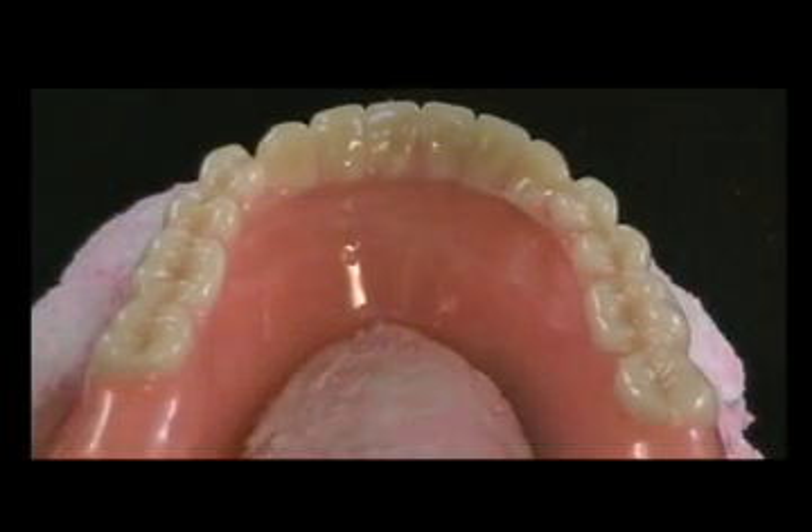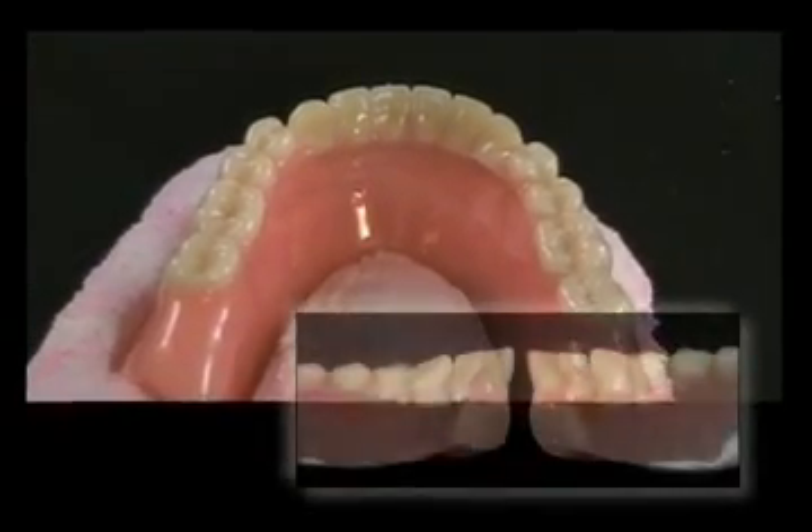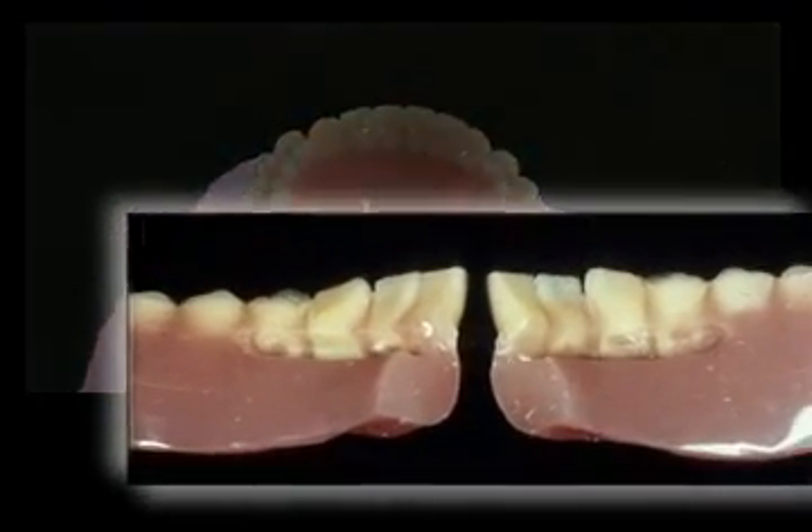The initial step is to correctly reassemble the fractured full denture and secure it with cyanoacrylate glue. Make a putty matrix to hold the assembled denture in its correct position.